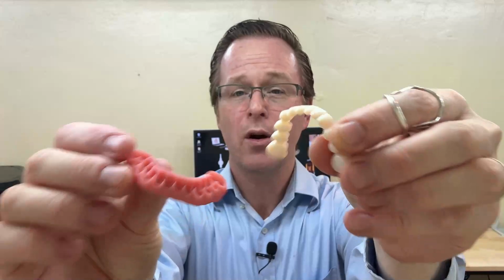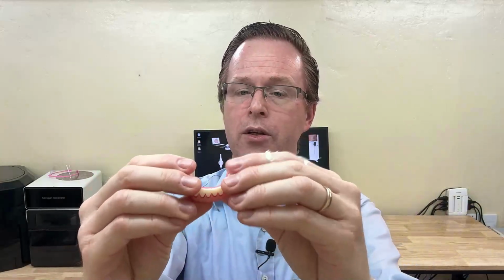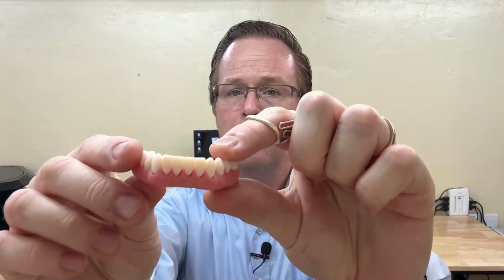But if you want to create a prosthesis that's got a separate 3D printed pink base with a segmented tooth arch, you print the pink version, then you print the tooth color version, and in your lab or your assistants, you glue the parts together, it'll print a natural, very streamlined two-piece prosthesis. How do I do that? Now, there's two ways to do it.